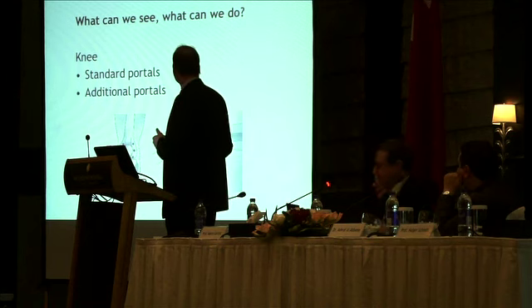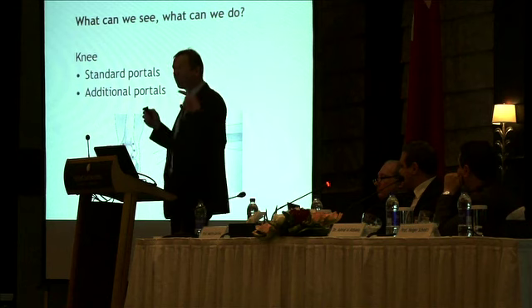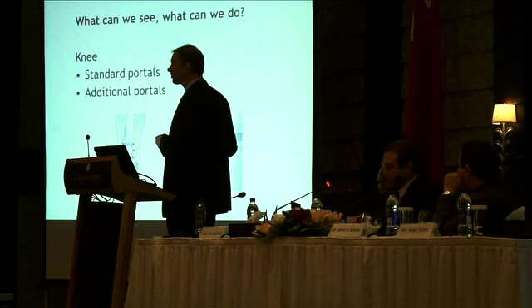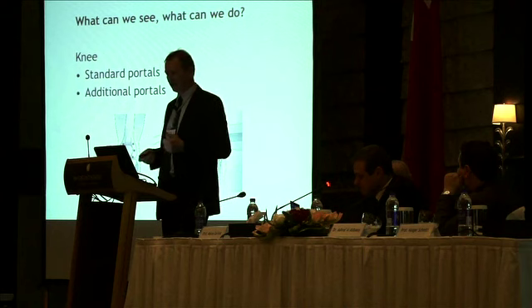And you see here in the front, these are the additional anterior approaches, but you also have to look at the posterior part of the knee joint. And then we need a posterolateral approach or a posteromedial approach, because we want to see 100% of the synovia of the knee joint.